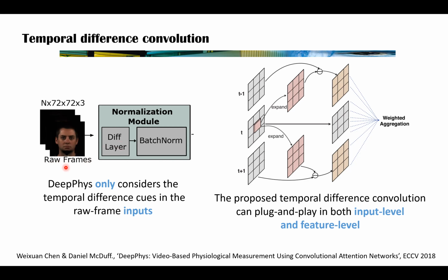Usually, it will calculate a difference from the sensor noise or some other undesired trend, but not our desired rPPG color trends. So we want to calculate this kind of difference at the feature level, right?